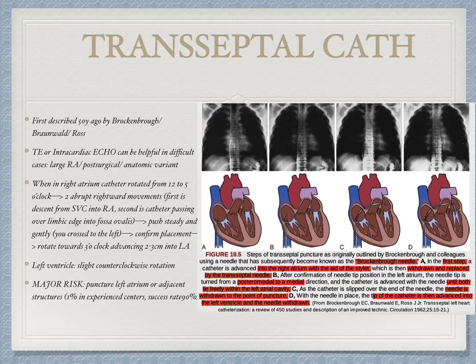It's more difficult technically, and you have to watch out since you have a needle that could puncture the left atrium or adjacent structures. This happens only in 1% in experienced centers with success rates around 90%. For the technical aspects, pause the video.